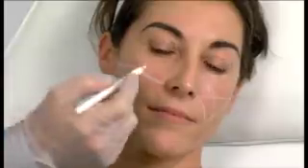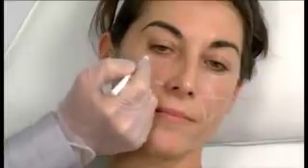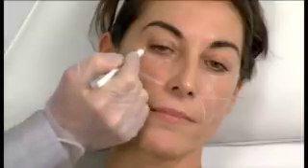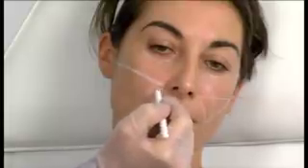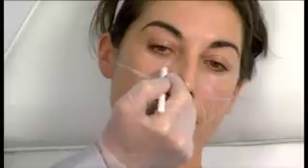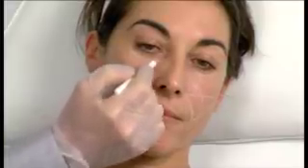Now, I also want to show you some other anatomical structures. This is the infraorbital rim. I've already drawn it on the other side of the face, and this is a nasolabial fold, which you don't really see on Valerie. And parallel to the nasolabial fold, I draw a line from the tear trough down over the face, and we will get to the no injection zone.